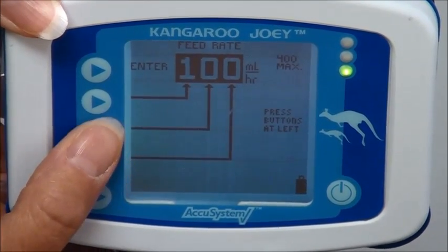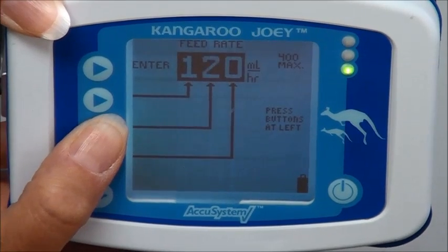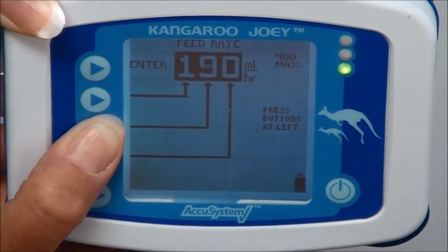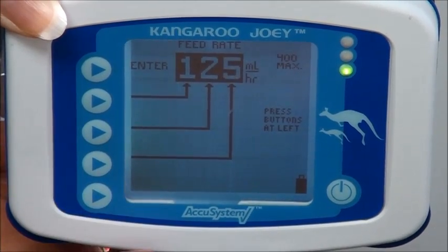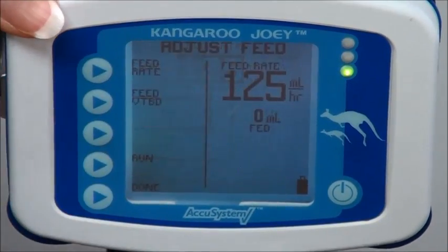I'm going to put in 125 milliliters. So I'm just going to push the appropriate arrows till I get to where I need to go. If you overshoot your numbers, you can just keep pushing and it'll start over. So I've got 125. Alright, and then I'm going to push the enter button to save it.